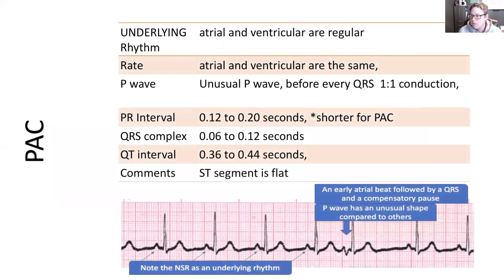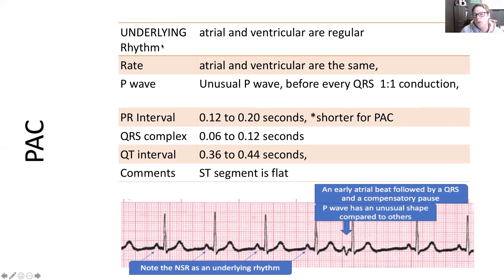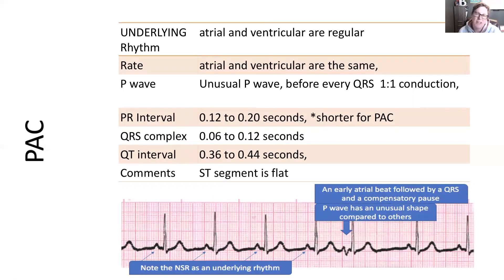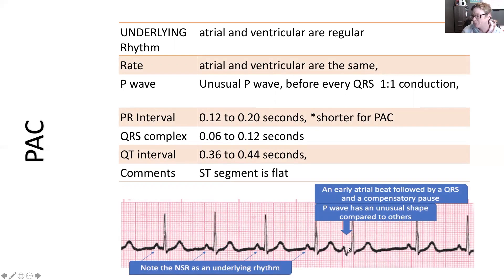Reviewing this in terms of the chart, the underlying rhythm in this case is normal sinus rhythm. The underlying rhythm will have all the normal parameters, except the P wave will be unusual and the PR interval for that particular impulse will be shorter — it's really difficult to measure precisely. Everything else will be normal.